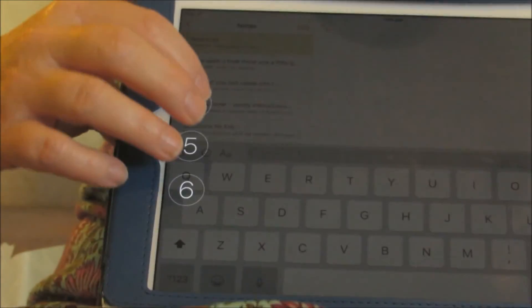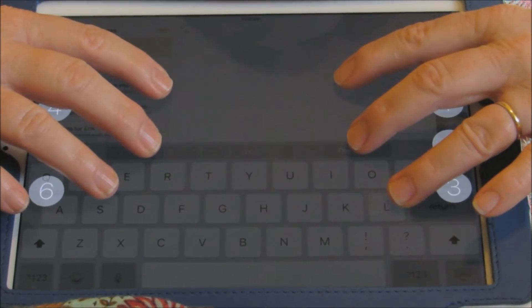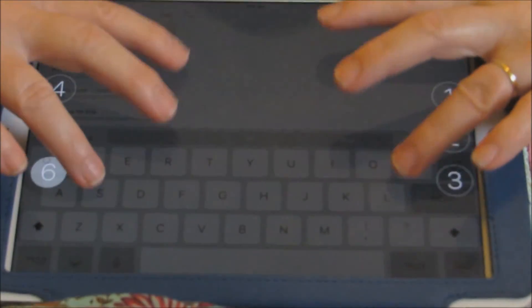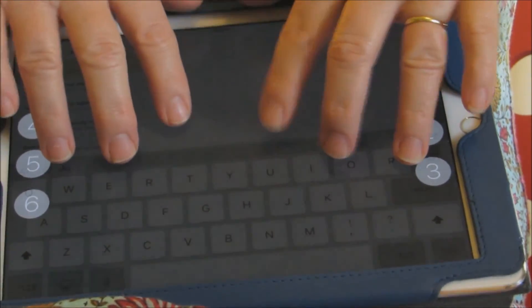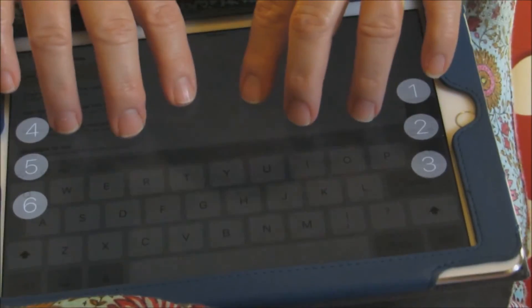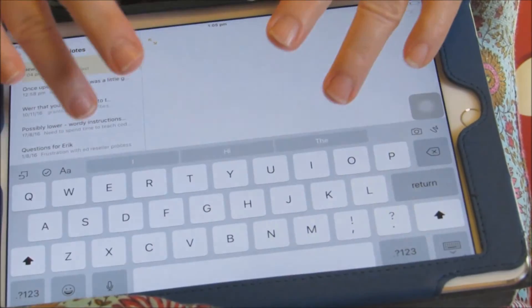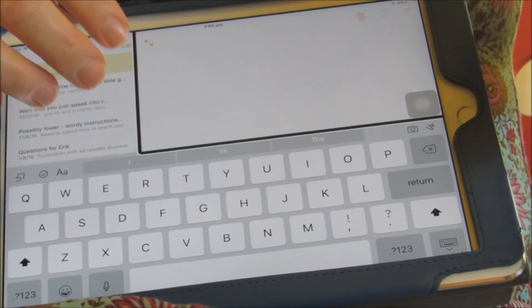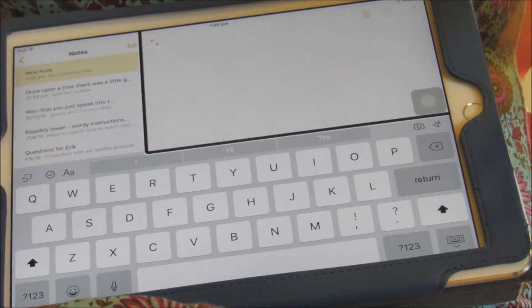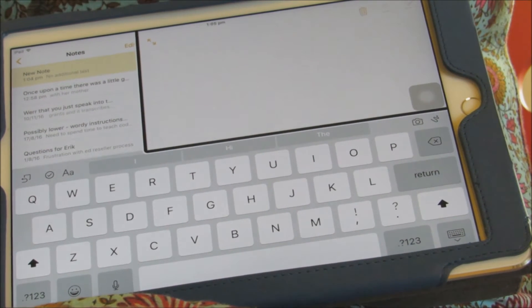So you can see that the Braille keyboard is showing on the screen there. I can put my fingers on and type in Braille, and the text would be entered in the Notes field.